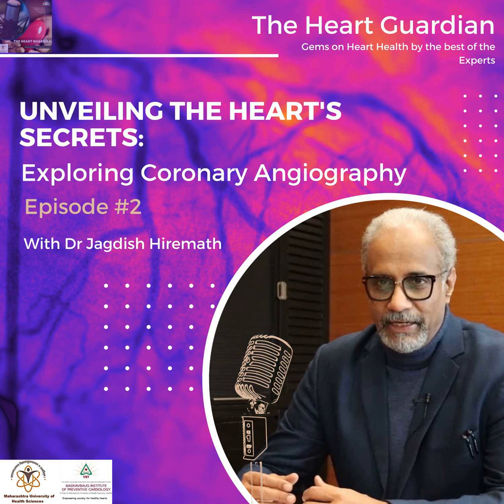Through this cannula, a long thin tube, the catheter, is passed up the artery against the bloodstream. This travel, however, is quick, painless and effortless. The catheter, especially the tip of it, is observed by the X-ray control. For the right and left coronary artery, the tips of the catheters are shaped differently. The catheter is designed in such a way that it enters the origin of the respective arteries. It sits there a few millimeters inside the origin of the artery.